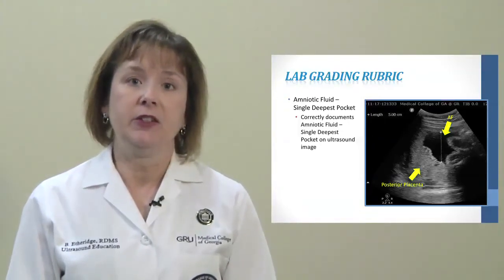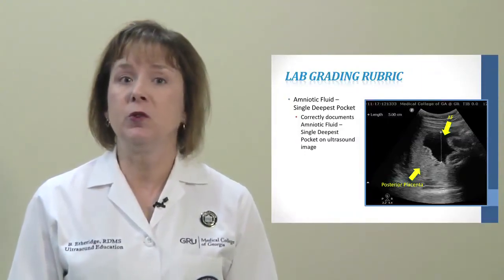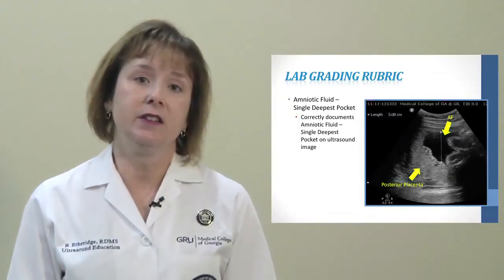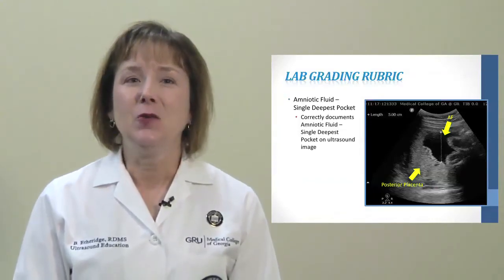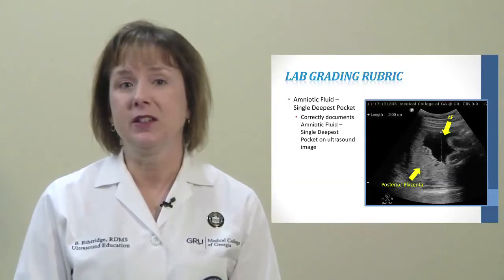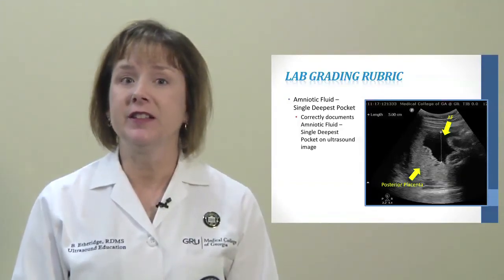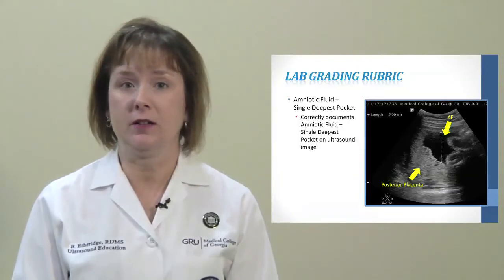Also keep in mind that you will be scanning different OB patients, so your images will not look just like these in this video. The OB patients you scan may have different fetal positions, placental locations, and also may have variable heart rates and sizes of amniotic fluid pockets.